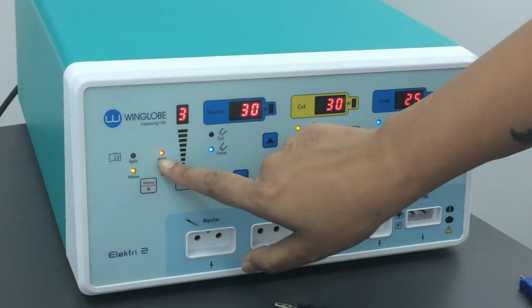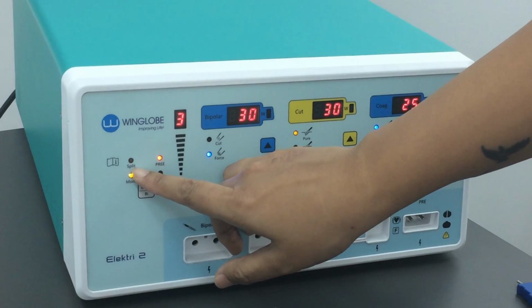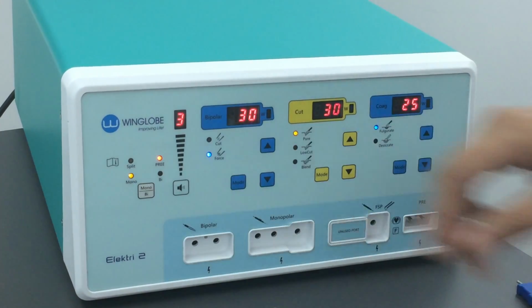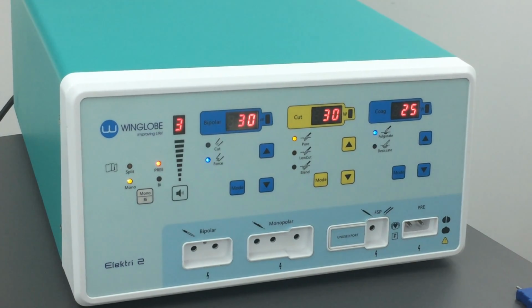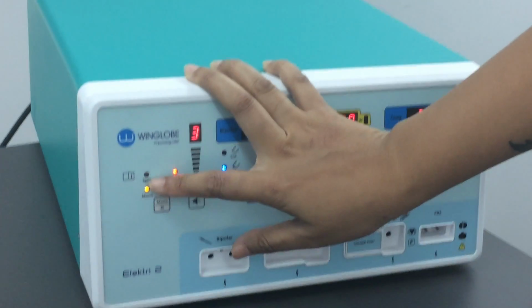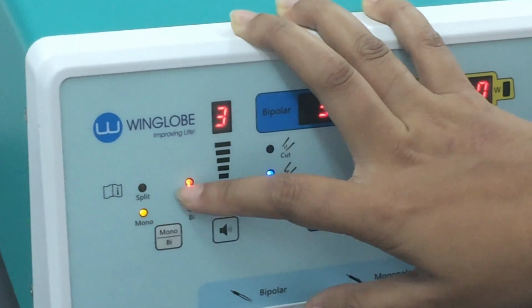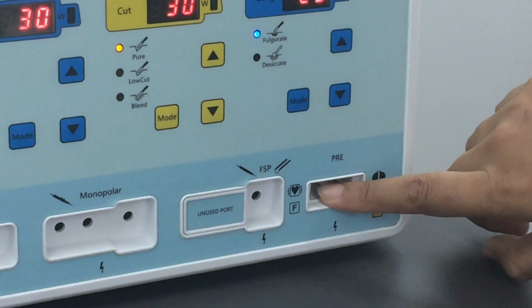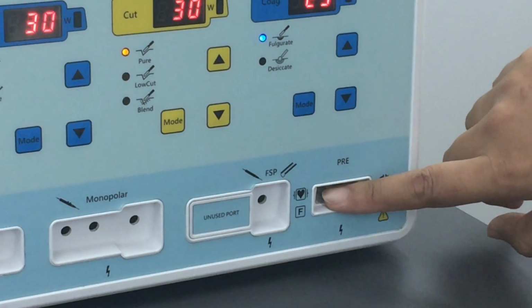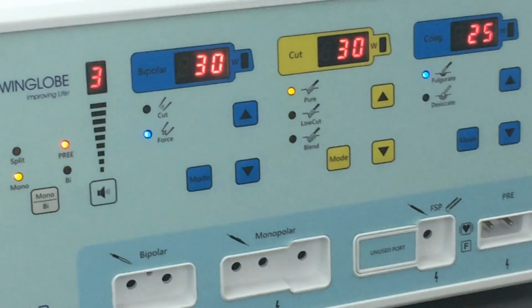As you can see, there are four buttons here. First is for the split, which is an indicator whenever you're using a split patient electrode. If you're using a non-split, that will not come on. Next is your patient return electrode error. It is showing an error here because your patient return electrode is not connected. It will show an error until it is connected properly at the patient site as well.